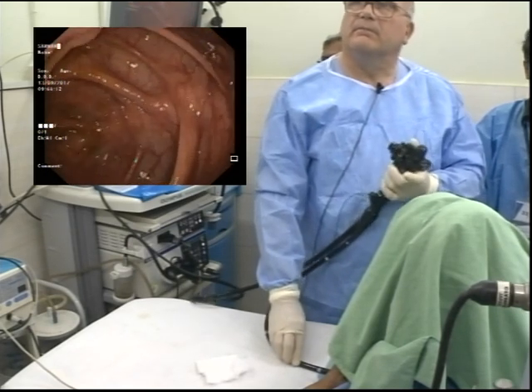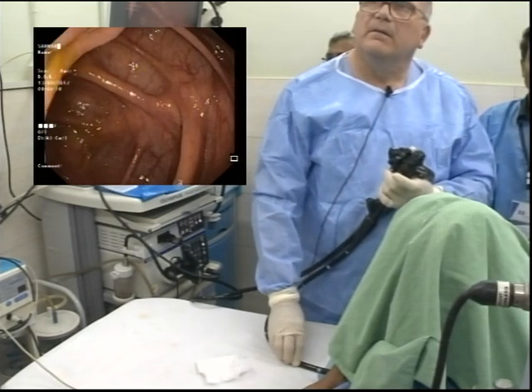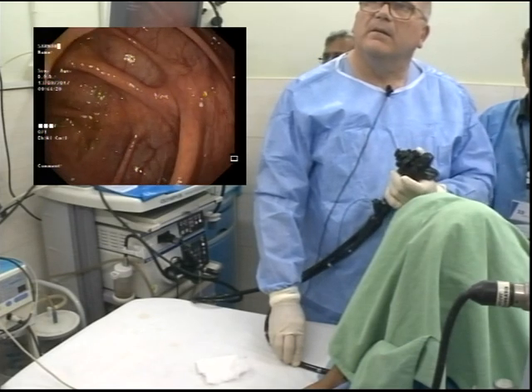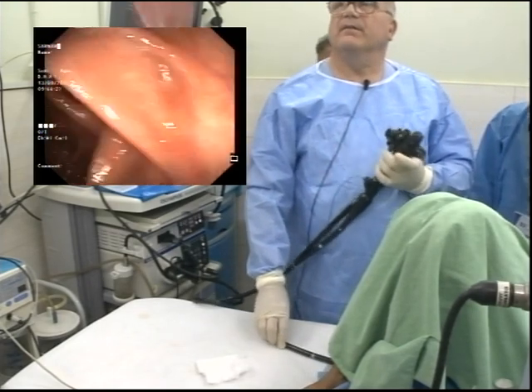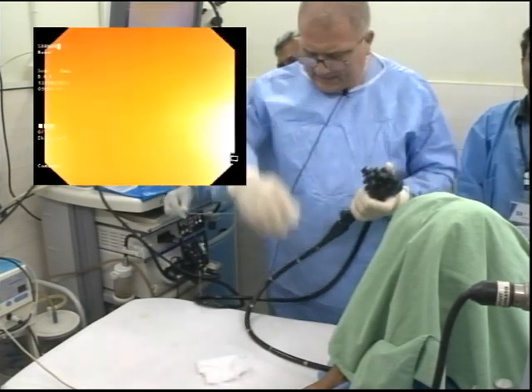Ileocecal valve on the left of the screen at about 10 o'clock. And then you can see a little opening there. You can see the appendicular orifice, and you can see the triradiate folds as well. Excellent. So now, as we come back, if you look, the right hand is here.